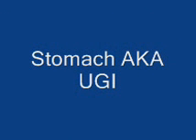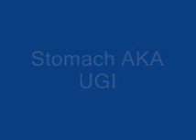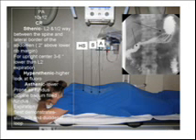Upper GI or stomach, posterior, anterior, or PA, 10 by 12 image receptor. Patient prone with arms up beside the head. The central ray for sthenic body habitus is the level of L1, or 2 inches above the lower lateral rib margin and 1 inch left of the vertebral column.